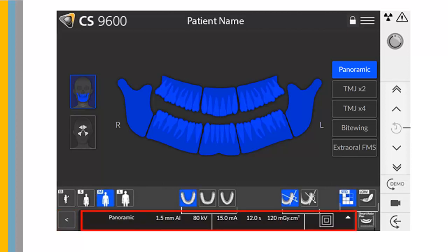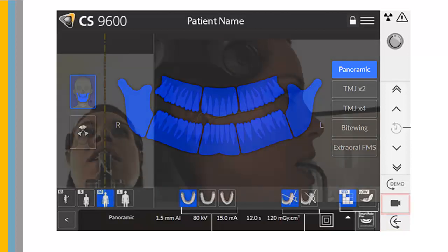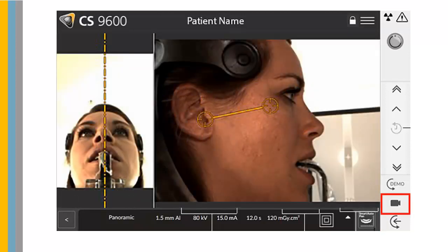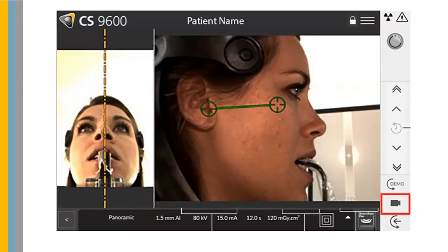The Exposure Parameter Panel enables you to choose and save exposure parameters for radiological image acquisition. Patient Entry positions the unit in patient entry mode. Live Positioning Camera enables the cameras for live positioning assistance.